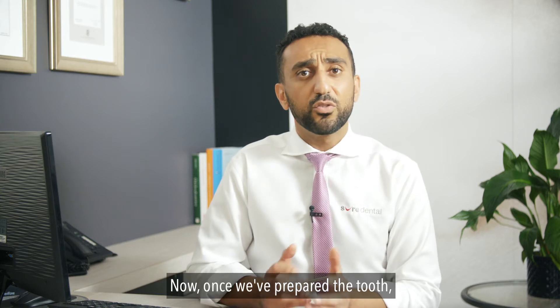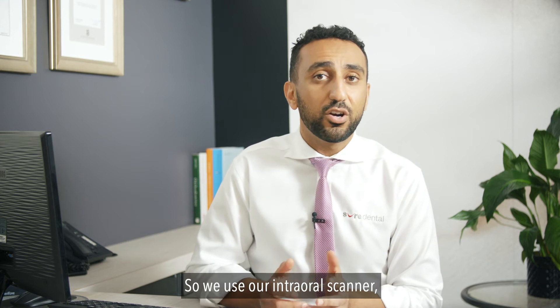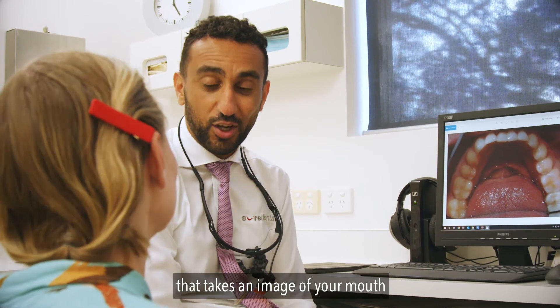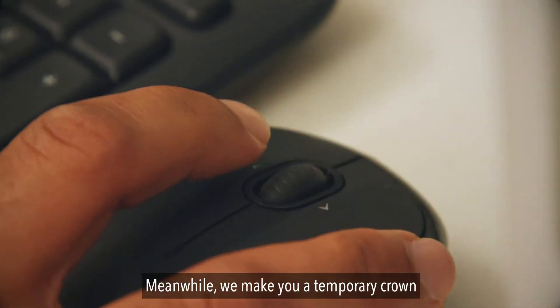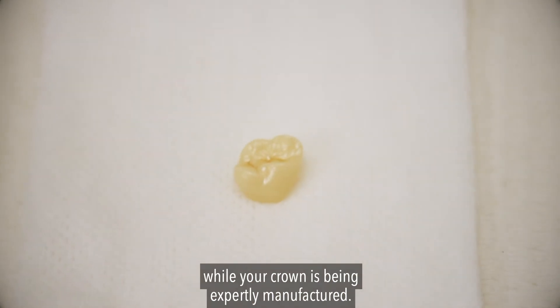Once we've prepared the tooth, we want to get a really accurate image of what's going on in there, so we use our intraoral scanner — a super accurate 3D scanner that takes an image of your mouth and sends it over to our laboratory. Meanwhile, we make you a temporary crown that will be comfortable for you to wear while your crown is being expertly manufactured.